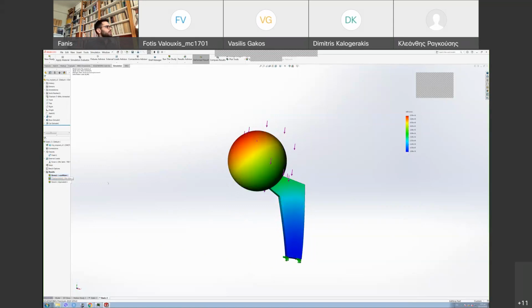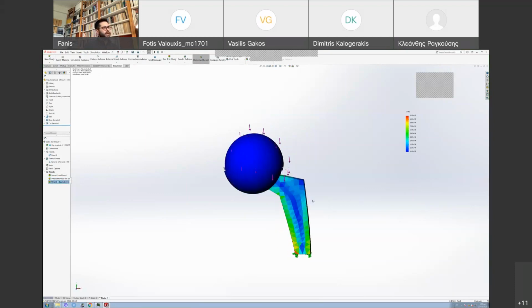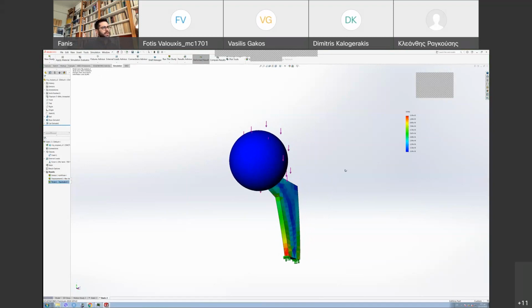Okay. You can also see the displacement. Where is the displacement larger, where it's smaller. Okay, that makes sense because here we have a fixed geometry, we have fixed it, and this is free, so displacement should be larger here. That makes sense, okay? And you also have the strain. And that's an easy way to study static loading.